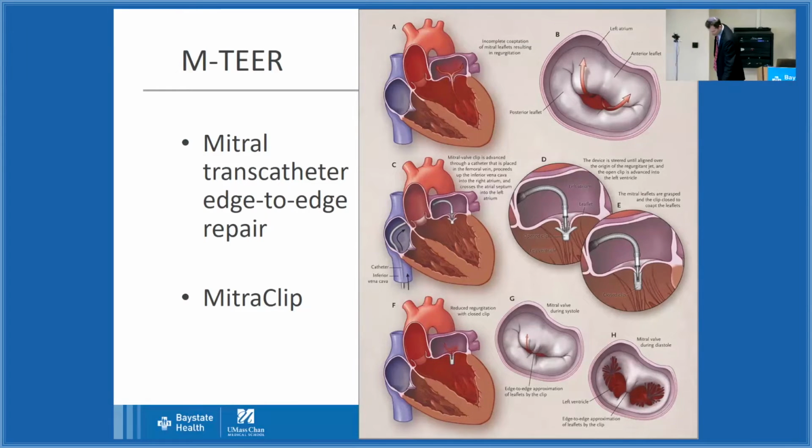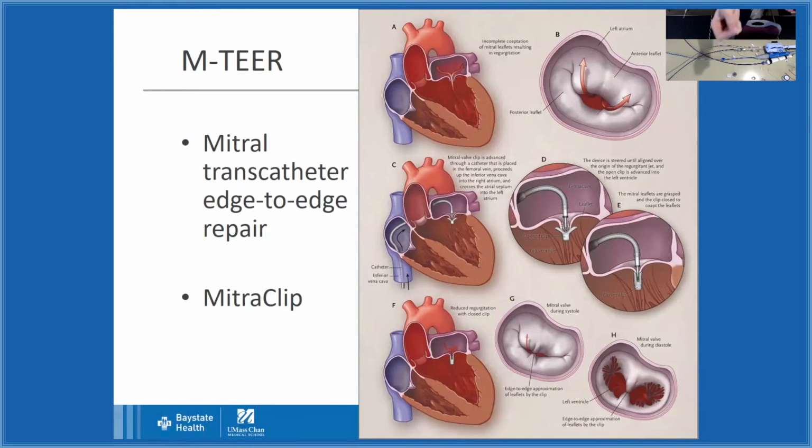I'm going to show you here the MitraClip that I'm about to pass around. When it's open, you'll see that there are grippers that grab onto each of the leaflets and then pull them together. The one I'm going to pass around is closed. It's been locked. And once the lock is deployed, there ain't no way to undeploy it. So that's a forever thing. I'm going to pass around a MitraClip. Super small, careful not to drop it in your chili.